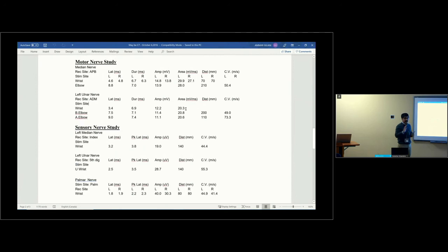Similarly, biceps and brachioradialis are commonly associated with C6, but I have cases where they are predominantly supplied by C5, and you have a clinical picture of C6. If you don't do pronator or flexor carpi radialis, you may miss it. So depending on what the clinical picture is guiding you to, you have to guide your test accordingly to rule out a certain diagnosis concretely.